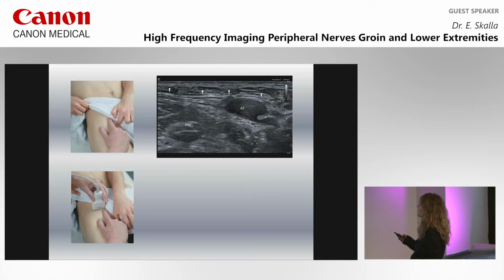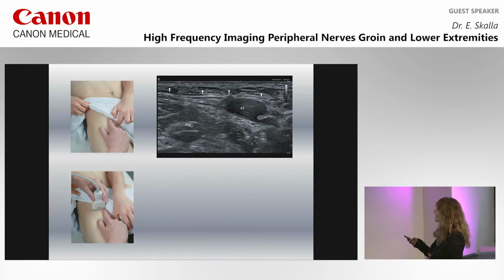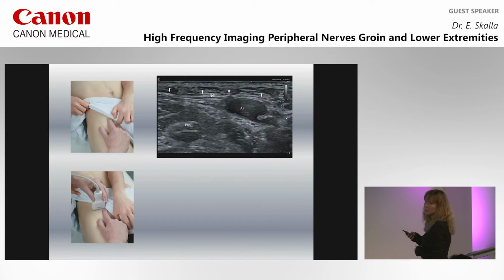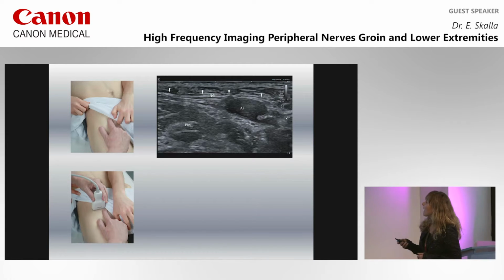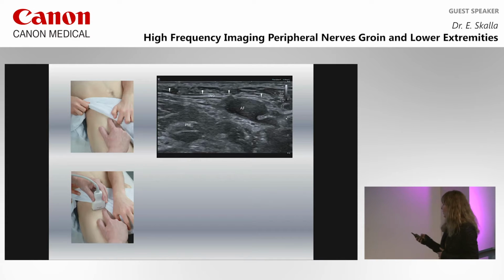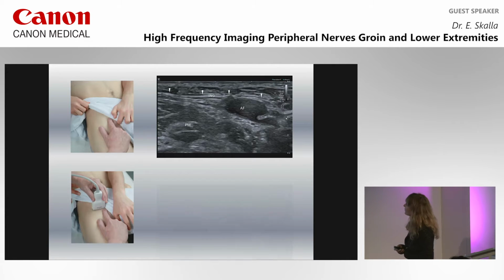The femoral artery, and with a little bit of pressure with the probe, the vein is compressed. This hyperechogenic band over the vessels is the inguinal ligament. We have here the psoas muscle, so this is the lacuna musculorum, and usually the nerve is lying directly in the neighborhood of the vessels. You can see here this honeycombing pattern of a typical cross-section area of a nerve.